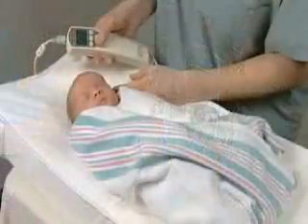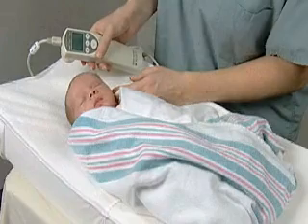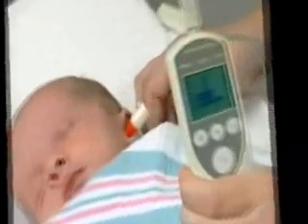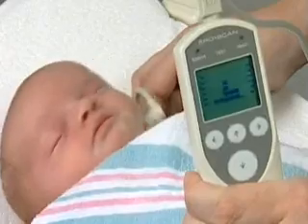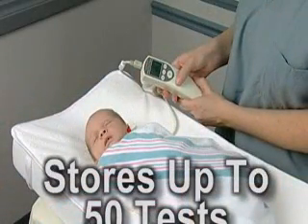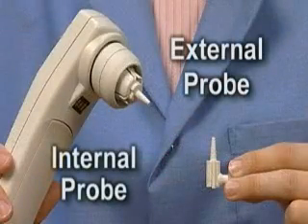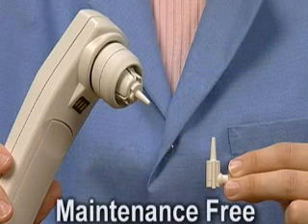The AeroScan is simple to use yet highly flexible. Housed completely within the hand-held unit, the AeroScan is capable of performing either distortion product otoacoustic emissions, transient evoked otoacoustic emissions, or both in the same instrument and then storing up to 50 tests. For ease of use in testing all populations, the AeroScan comes with an internal and an external probe, and the tips of these probes are designed to be totally maintenance-free.